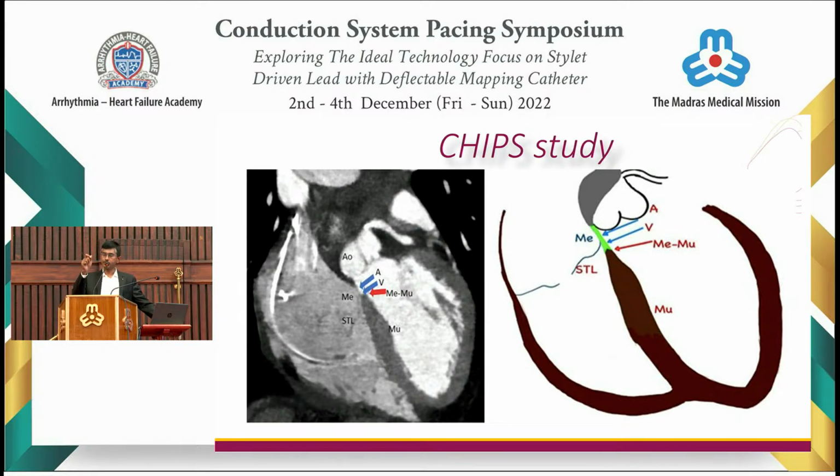In the CT scan, it's very much possible to delineate the septal attachment of the tricuspid valve leaflet. Very much in line with Cabrera's anatomical dissection, the point of attachment of the septal leaflet to the interventricular septum is what basically differentiates the RA from the right ventricle.